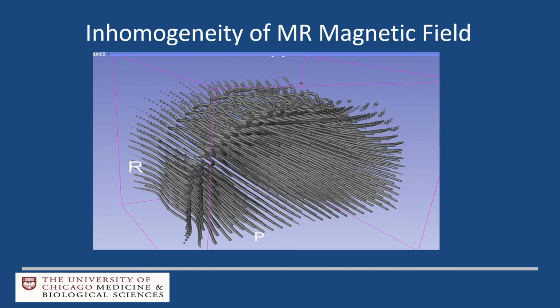The difference between MRI, of course, which is what we all aim for in intraop MRI, and CT is MRI gives you beautiful anatomic resolution and contrast. But if it comes to exact precision, we have a problem because we have a nonlinear distortion of the image, which means that it's more distorted, as you can see from these magnetic field lines, in the periphery than in the center, which means if you're operating in the center of the brain, implanting a deep brain stimulator, it's probably not relevant. But your fiducials are in the periphery. So if they are slightly distorted, then you don't get a complete orthogonal image.